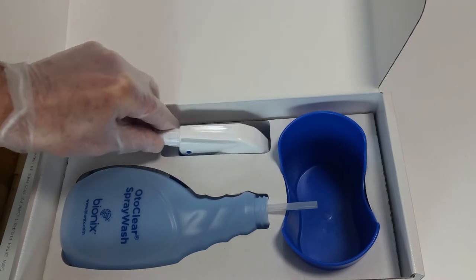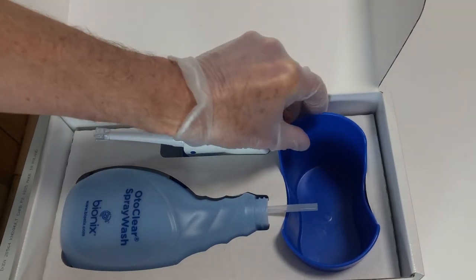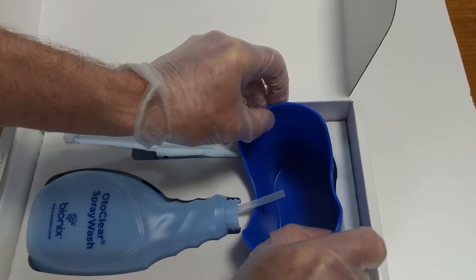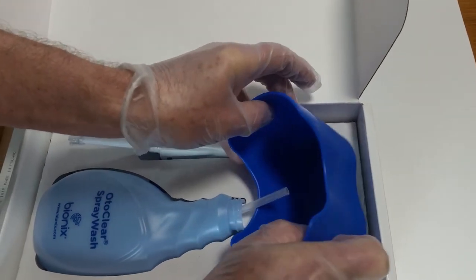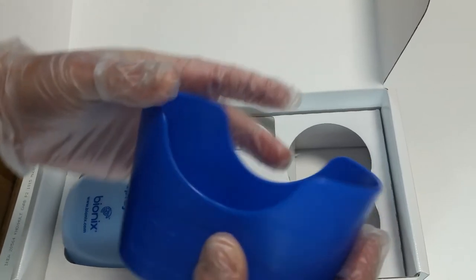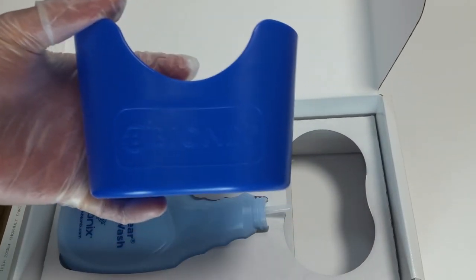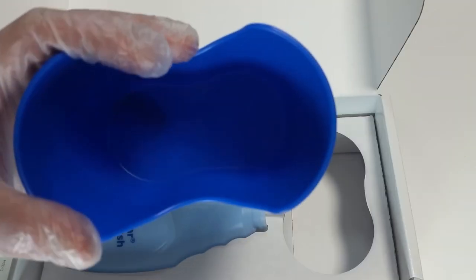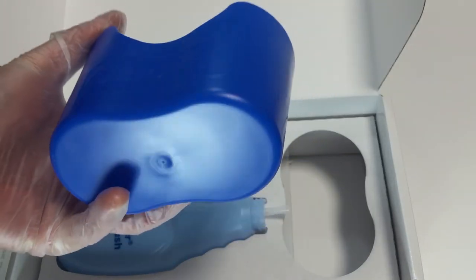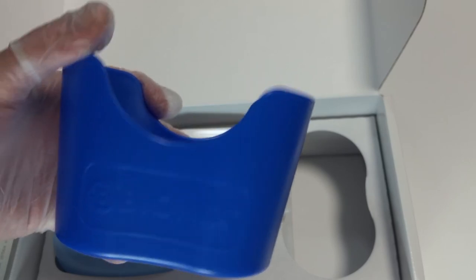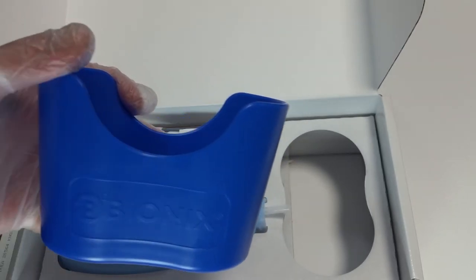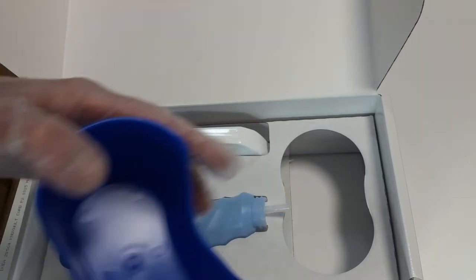Put that back in. Here's the collection dish, collecting the effluent as it drains back out of the ear. There's a close look at it. You can see there's quite a bit of volume in there. The scallops on either side of the dish make it easy to put it up underneath the patient's ear.